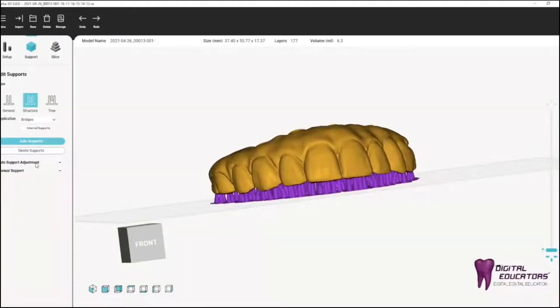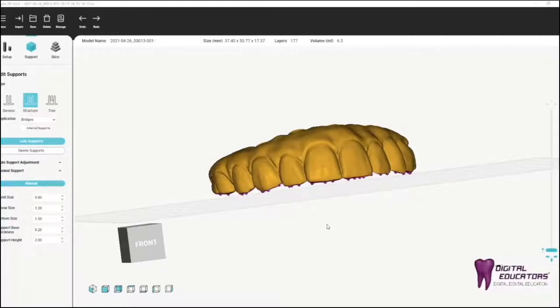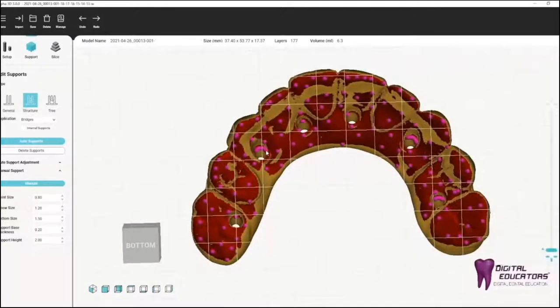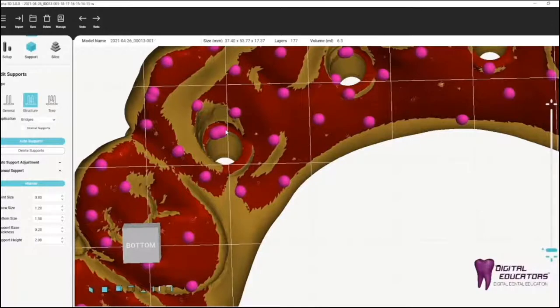One thing we'll want to do is edit the location of the supports. Although the software is smart enough to add the supports, it's not smart enough to know what actual type of model you have based on your individual model. So we're going to look at this by clicking on the manual tab to change the manual position of the supports. What we're going to do here is actually delete any of the support points that are going to attach within the screw access holes. We want those screw access holes to have a very high level of accuracy with printing, and the support structures are going to add little nubs to those areas, so we actually want to delete those.